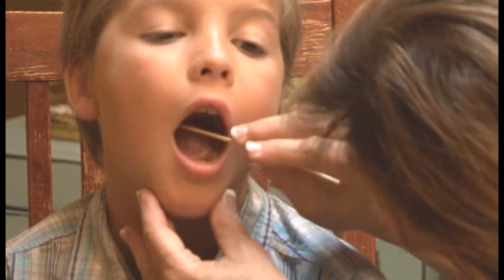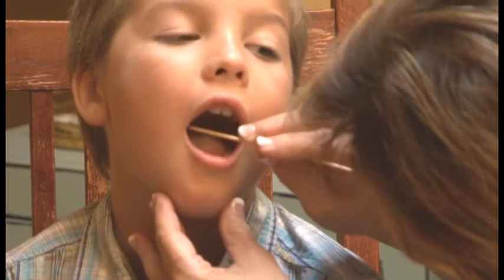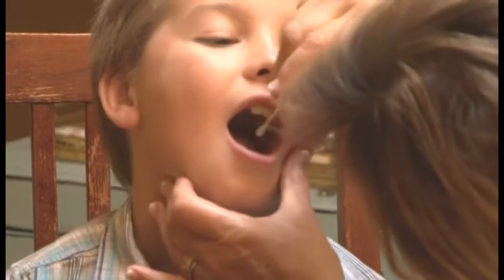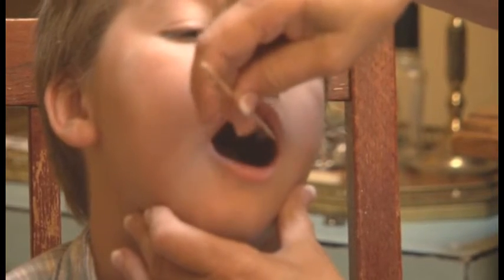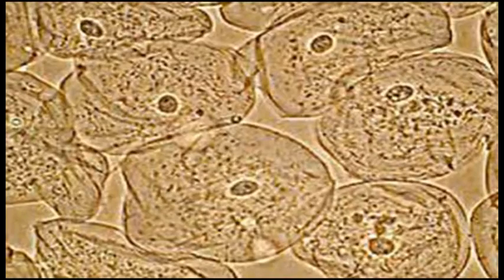Insert the cotton tip of the swab inside your child's cheeks, being careful not to touch the teeth, tongue, or gums. And firmly press against the middle of the cheek while rubbing and twirling the swab up and down and back and forth. About 10 times in each cheek is sufficient. By gently scraping the inside of your child's cheek, buccal cells are being harvested.